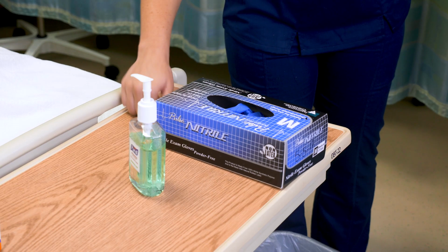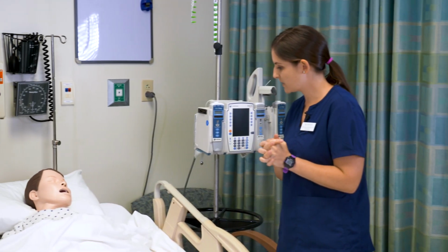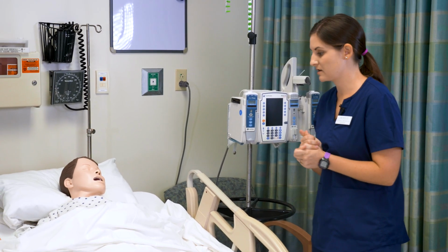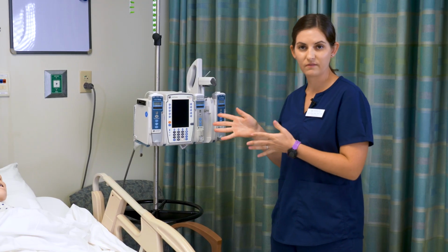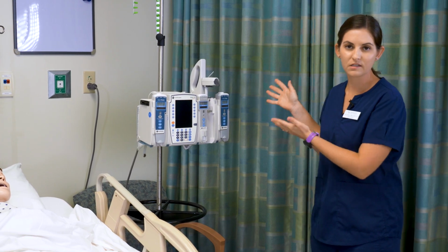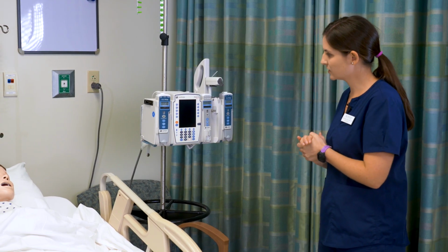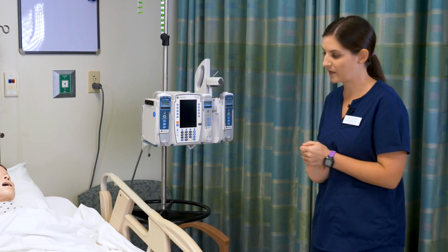I'm going to wash my hands. Hello, Mrs. Duncan. I'm getting ready to get your IV medication, so I'm just going to check your room and make sure we have everything here. Before I prepare my medication, I need to check my IV sites and my IV lines. I can see I have my Alaris IV pump here. I have a channel to administer my medication, and I do not have any previous lines, so I will need to gather all new tubing.